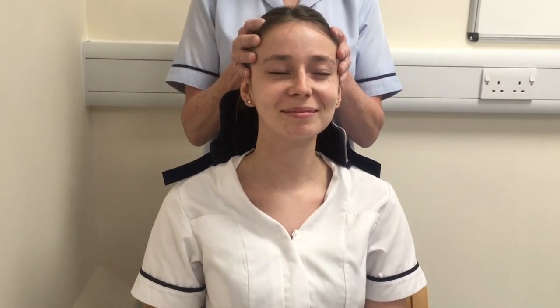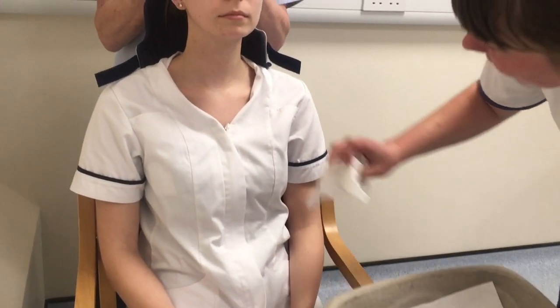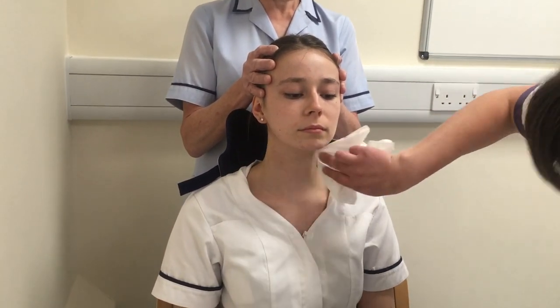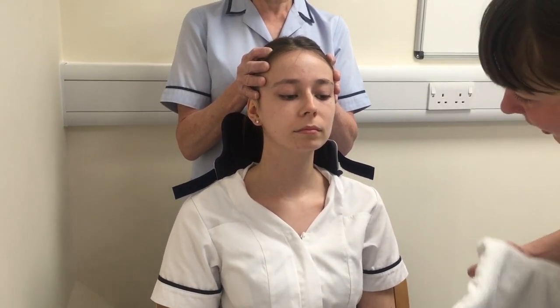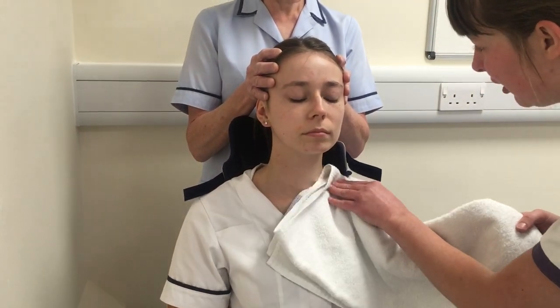We've got our wash bowl and we're going to do a little wash around the neck, making sure you're getting under the ears and around the chin. And then we're just going to pat it dry to continue to protect the skin.